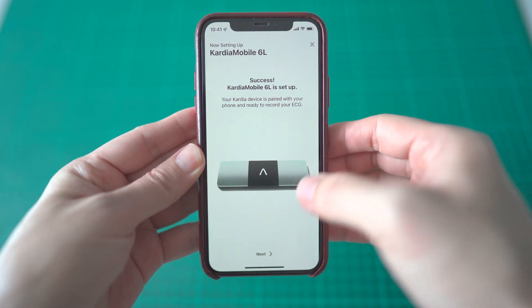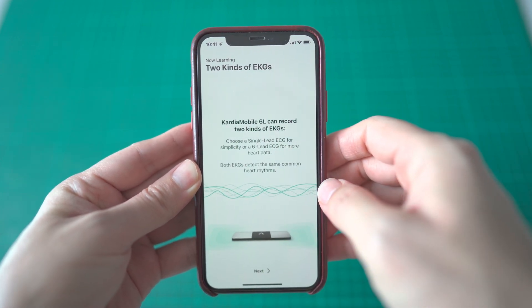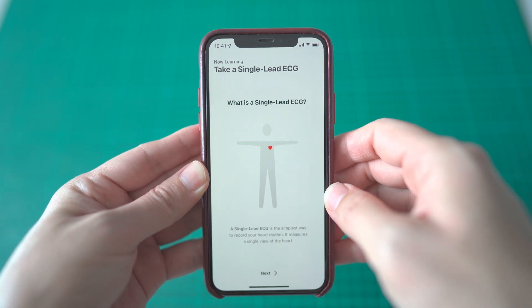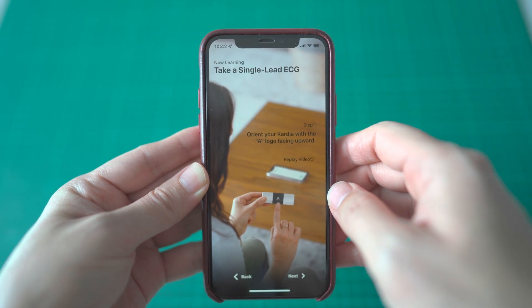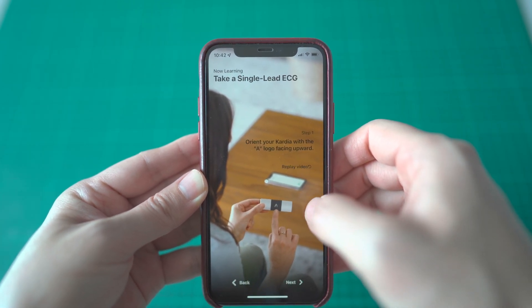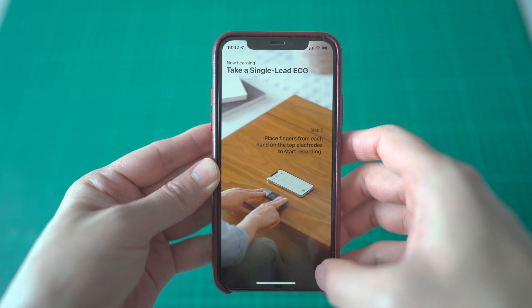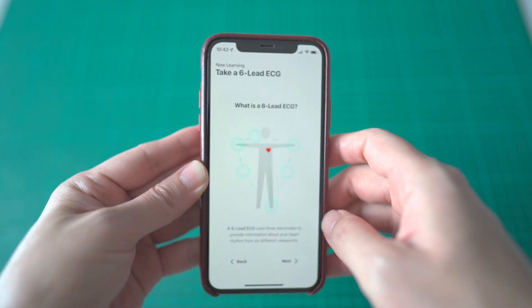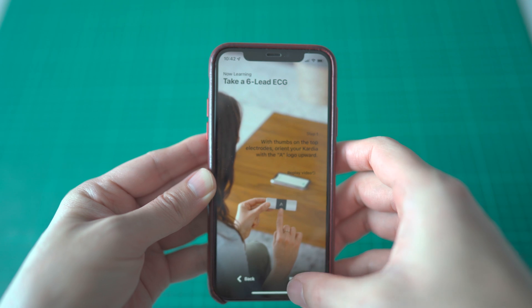The pairing process has been completed successfully. Next, you will learn how to use the Kardia Mobile 6L. Just follow along and you should be able to record your very first EKG in no time. The Kardia Mobile 6L is very much faster than you would expect.